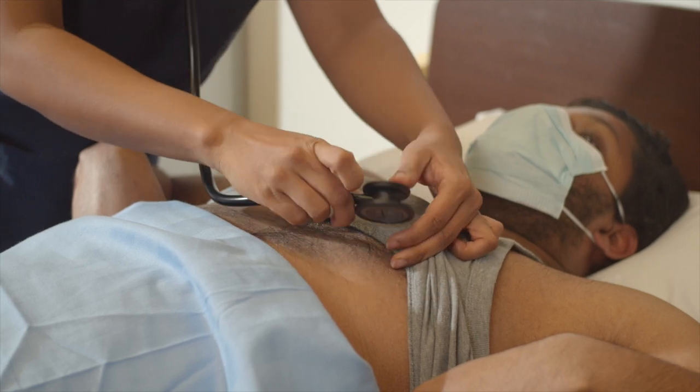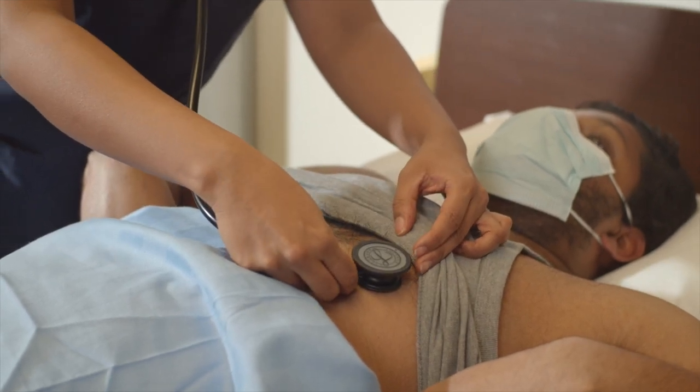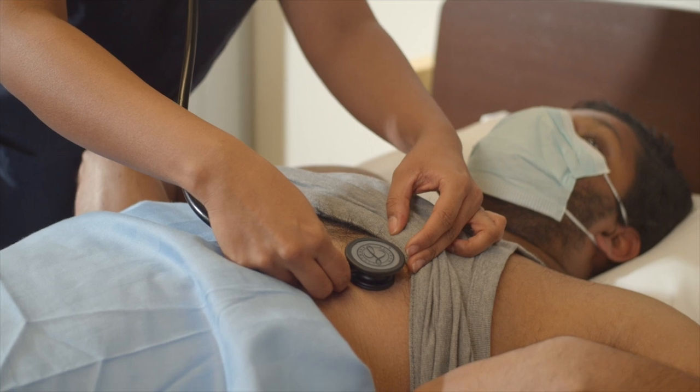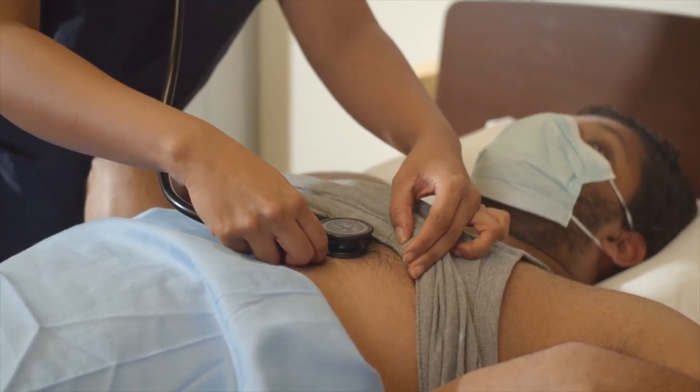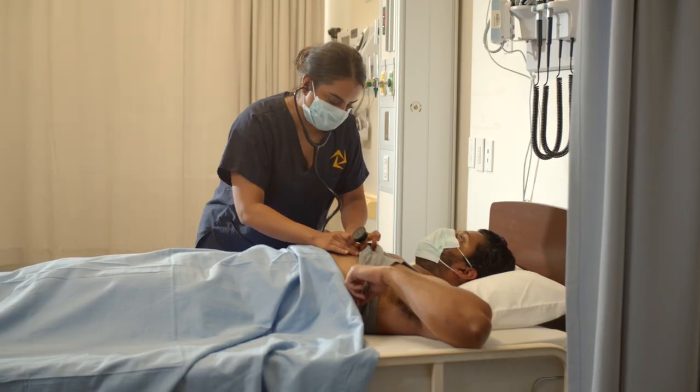I'm now going to listen with my bell in the same locations. I'm going to landmark back up.